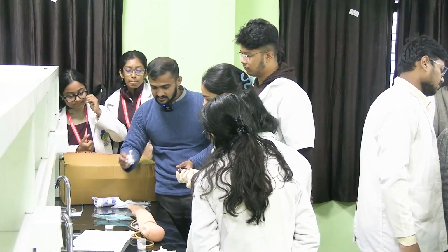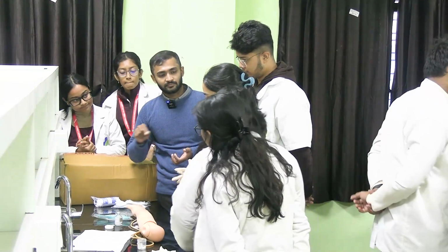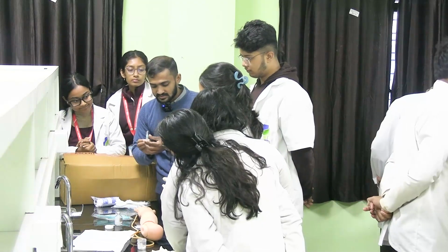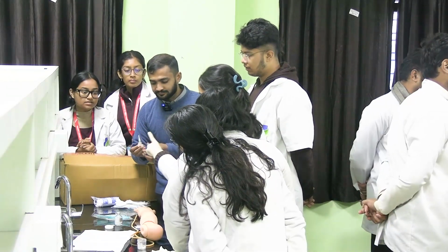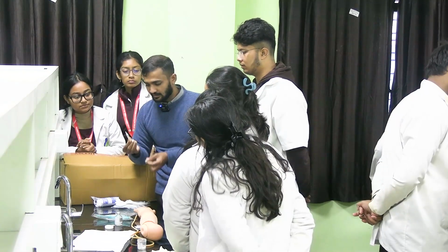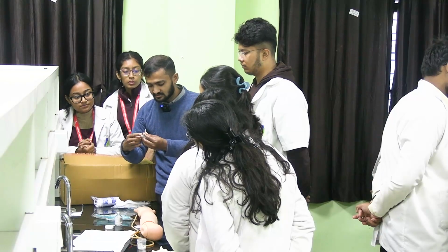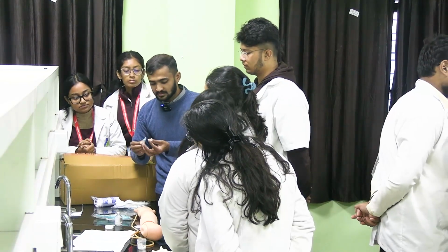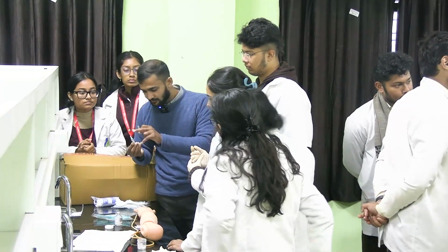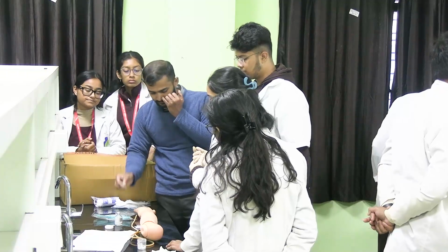Now this is the vial. How will you be taking the medicine from the vial? First, what are the parts here? This is the cap, the needle, then the barrel, and this is the plunger. The whole thing is known as a syringe. This needle also has a part, this tip, the bevel. So how will you be taking the drug? Can you tell?